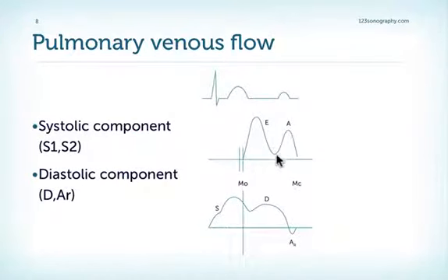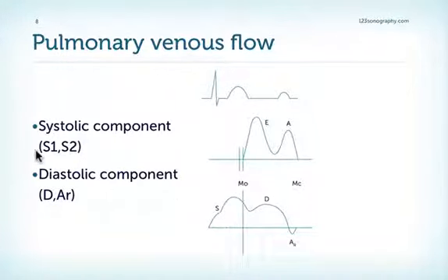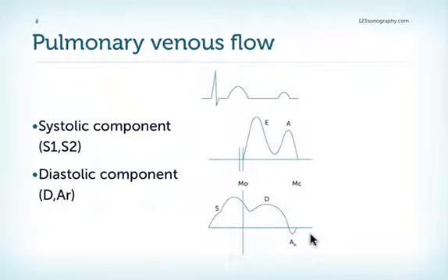We can use pulsed-wave Doppler to look at the different components of left atrial filling. We have the systolic components with an early and a late systolic component, S1 and S2, and the diastolic components with an early diastolic part and a retrograde flow during late diastole, which corresponds to left atrial contraction, also called AR.